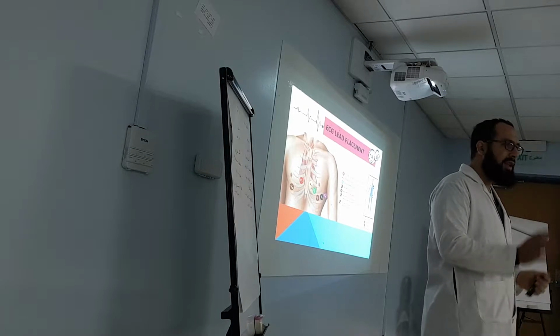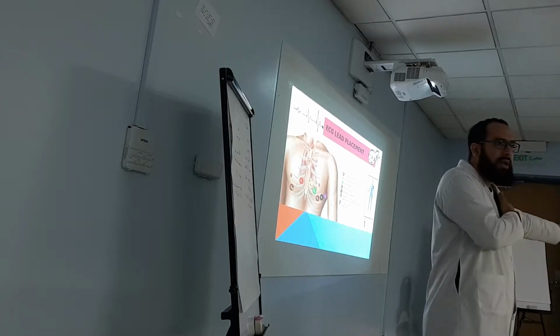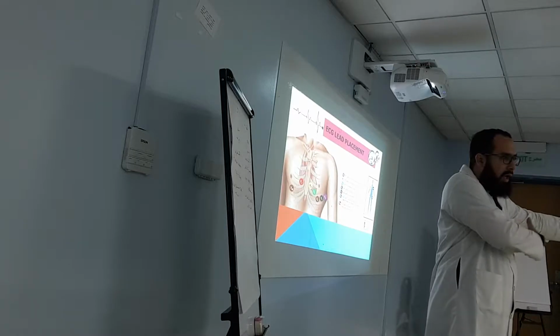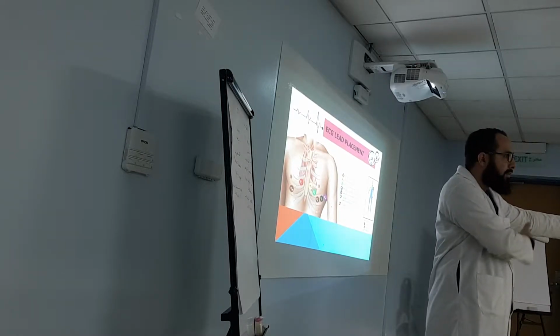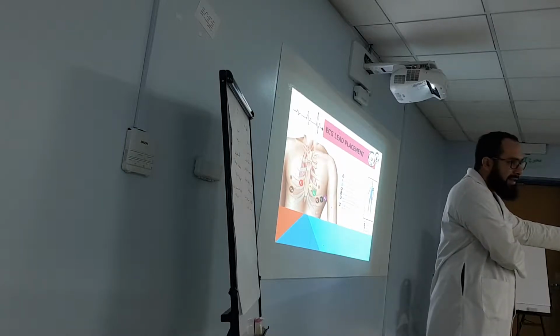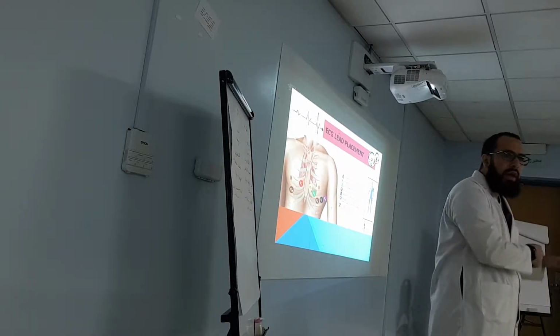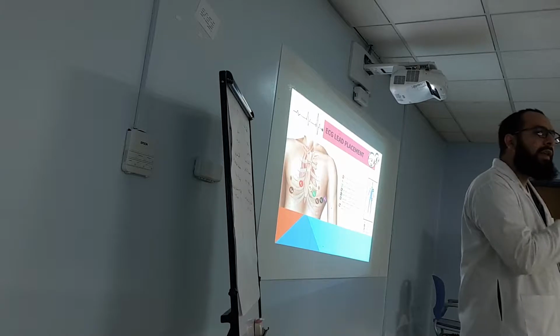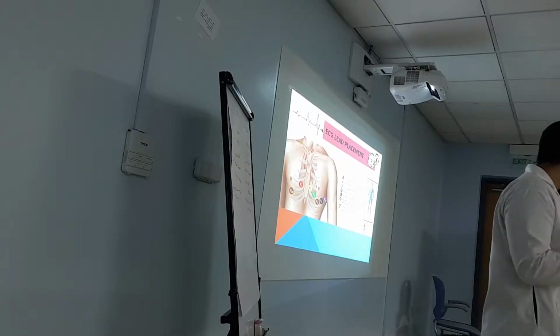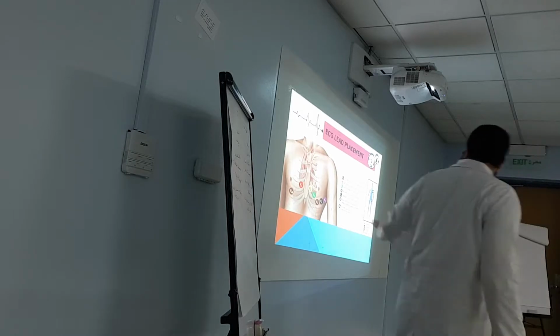So where is the mid-axillary line? Visually, between the beginning of the chest and the back. In between, this is the axilla. Divide the axilla in the mid-axillary line. Put lead 6 intersecting with the 5th intercostal space. Then lead 5 between 6 and 4. This is for the chest leads.